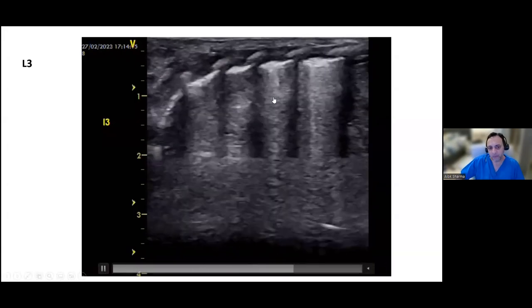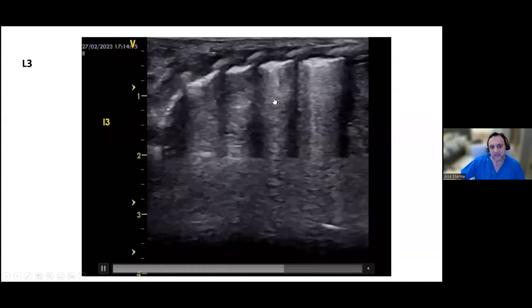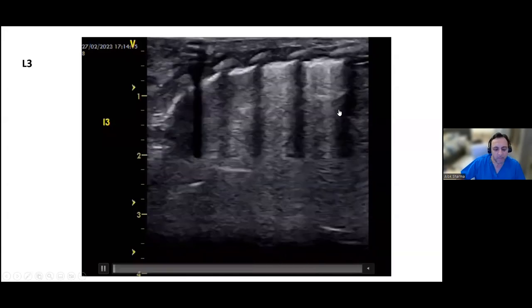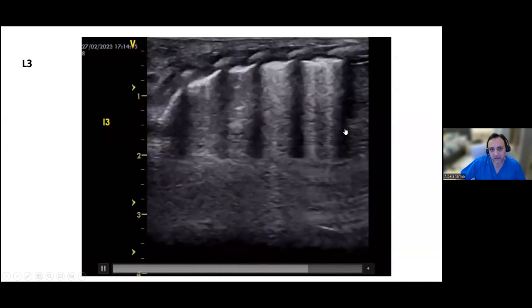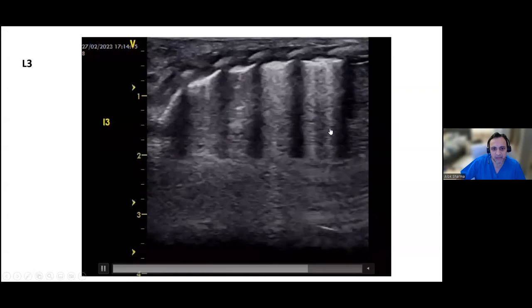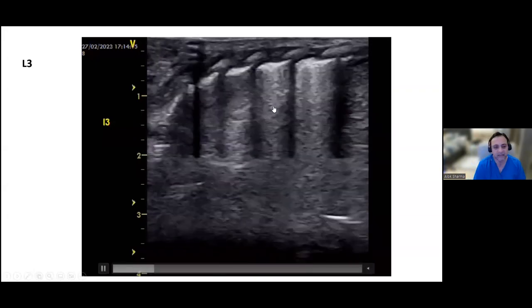For me, this is a dominant B profile. You don't see any A lines. You see on the right side of the screen, compact B lines. And basically what looks like spleen probably coming in at the bottom. But again, as the baby inspires, the lung and the pleura moves and you get a B profile just above the spleen. But as you come to the middle, that area that looks dense, it's very tricky. It's not bright enough for me to say that they are dynamic air bronchograms at this particular point.